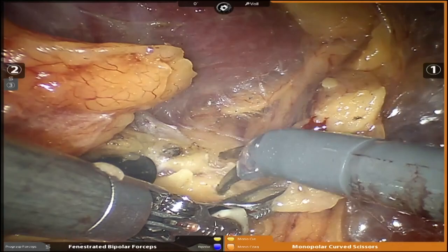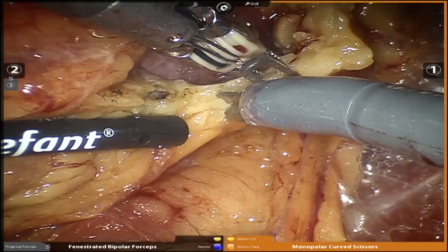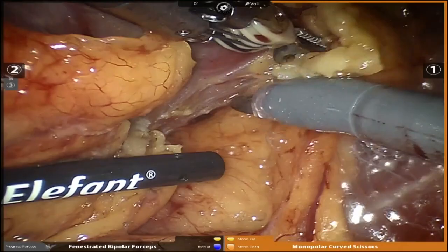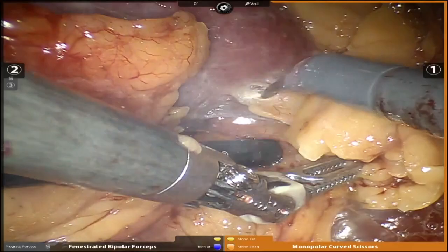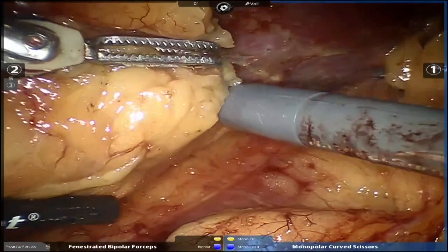Actually, our experience is the opposite. I think you have to be careful. Some people can track CO2 rapidly from the retroperitoneum into spaces, and you can get more subcutaneous emphysema and pneumomediastinums. We've actually had pneumoperitoneums or pneumothoraces as well. So I don't necessarily think the retroperitoneal approach mitigates a pulmonary issue. I think you and your anesthesiologist have to be quite aware that you could have increasing end-tidal CO2, and they may have to respirate accordingly to blow off that carbon dioxide. So unfortunately, it hasn't really gotten around that problem.